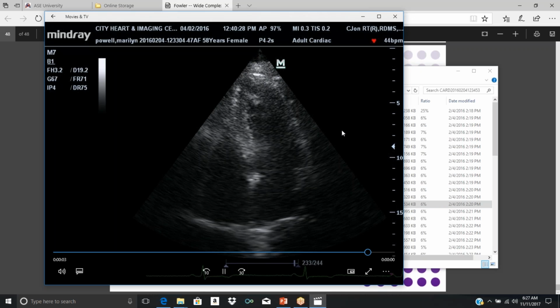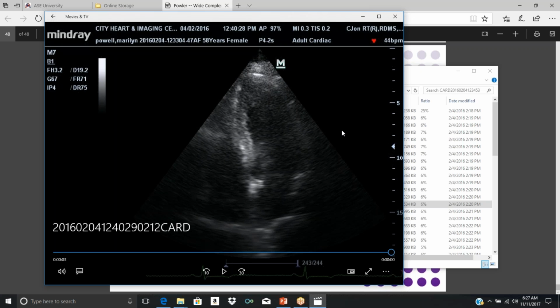So, all right, so you finish, and then you're supposed to get your apex. So in the short axis, if you start at the level of the aorta, you'll get your aorta in short axis. You'll get the base where you have the mitral valve. You get the mid-cavitary level where you get the papillary muscles. Then you go on to the apex. Remember, at the apex, you have only 4 segments or 4 regional walls: anterior, inferior, lateral, and septum. So then you move on to your apical views.